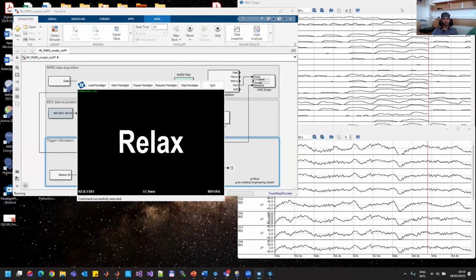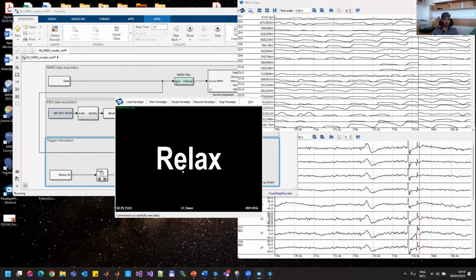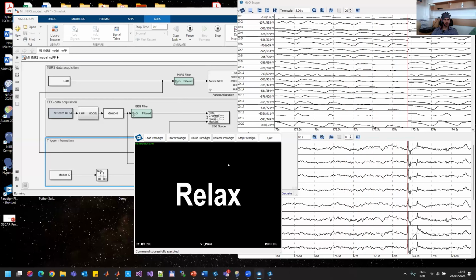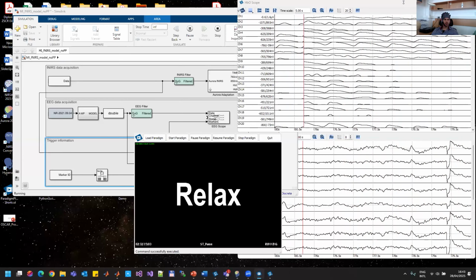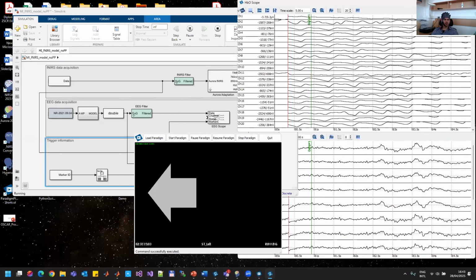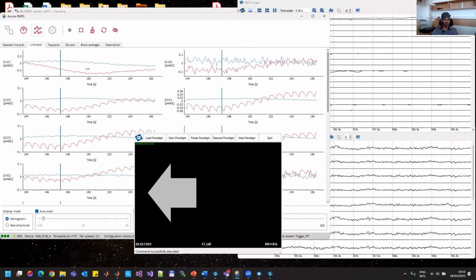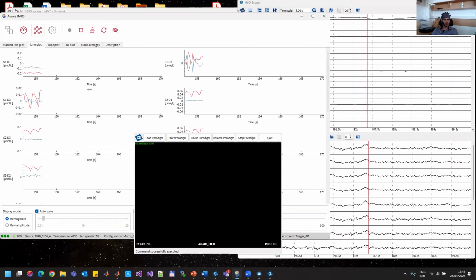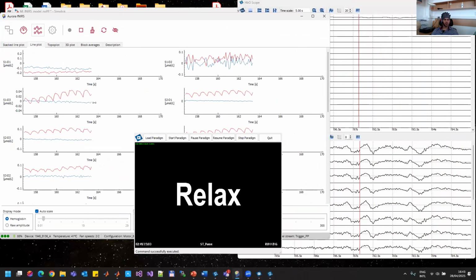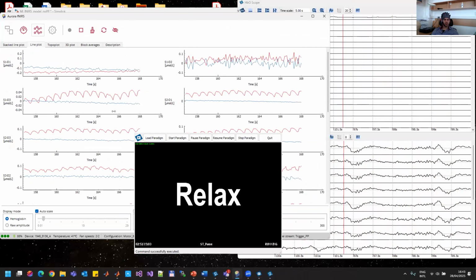So Alex, you could start, I don't know, imagining the movement, just following the paradigm. We don't have time now to perform a full experiment, but maybe we can see something in here. It's not the best plot. Let's add also Aurora. In Aurora, you can see it nicer. All of them work at the same time. Just relax.